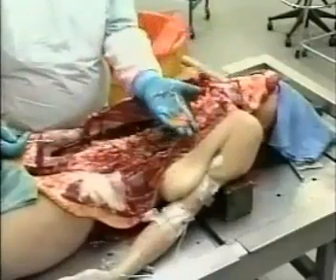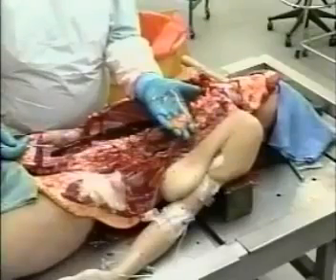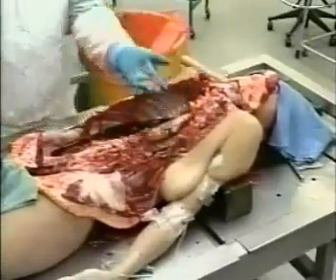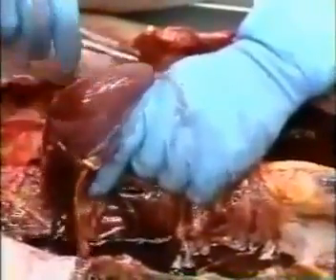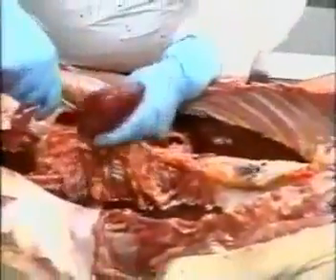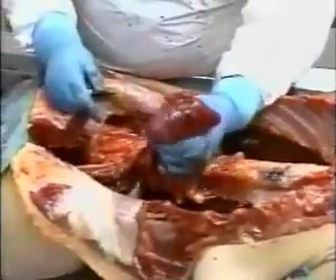That's an adrenal gland, which he's dissected off the top of one of the kidneys. Is that the left? Dave? Right. Right, yeah, okay. Now he's incising the renal capsule, which is a thin membrane that surrounds the kidneys, right there, and he'll strip that back to expose the kidney itself and then remove the kidney.